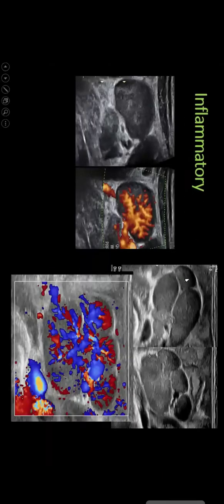This is how we see multiple hypoechoic nodes. The vascular pattern is typical, hilar vessel with ramifications and typical arborization. This is the normal hyperemic pattern. When nodes are matted, heterogenic in echotexture, with necrotic changes and calcifications present, necrotic abscesses, nodal abscesses, these are commonly seen in tuberculosis.